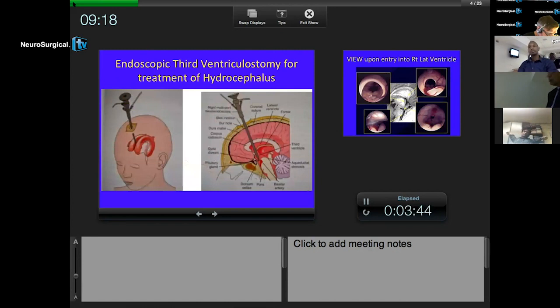And that essentially has been chosen because when you're using a rigid endoscope, that line is the straight line between the basal cistern in front of the basilar artery and the foramen of Monro. Because if you're a bit further forward, you're going to struggle and pull upon the foramen of Monro, and on the fornix rather. And if you pull on or tag or damage the fornix, of course, the patient will have memory problems.